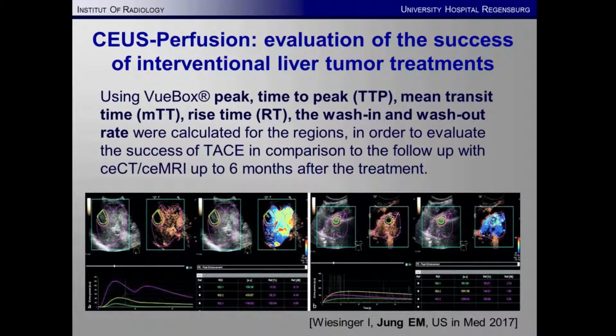The next and last step at this time for our team would be that we use a new external quantification software for the DICOM loops, and you could use it to quantify HCC lesions for time to peak, mean transit time, rise time, washout rate before treatment, and for the follow-up. Look at this green line and yellow line after successful treatment. You have a devascularization of the tumor vessels.